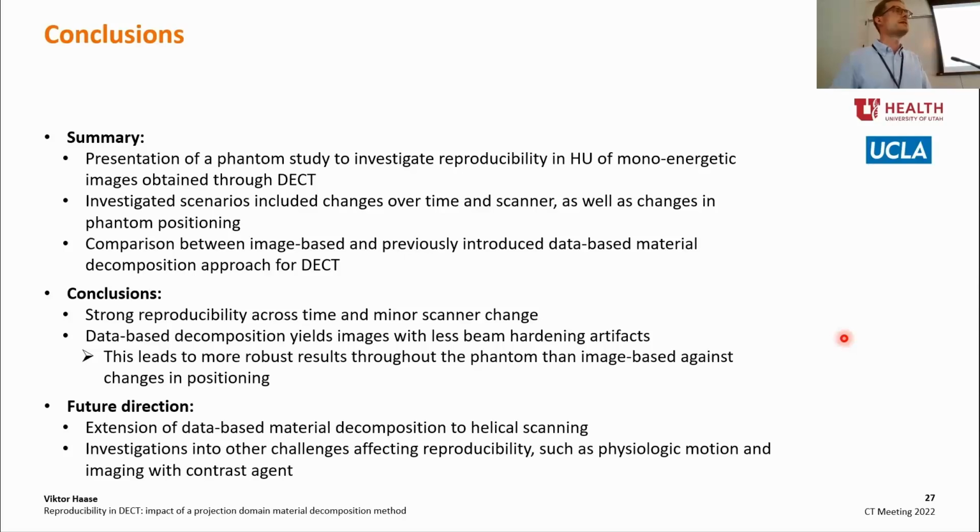I have another question. You're doing the study for dual energy CT here. So have you ever considered to do a multi-material beam hardening correction on single energy CT and see how the reproducibility is there? Yeah, that was not really in our scope, but I agree that's also a very interesting topic.